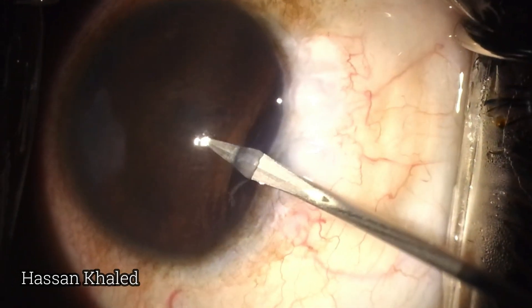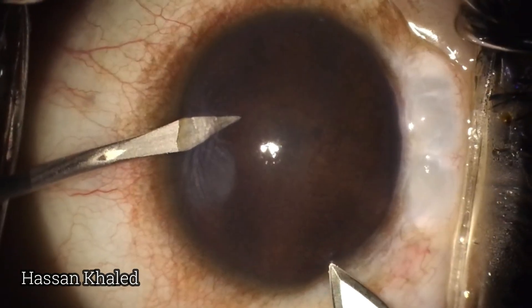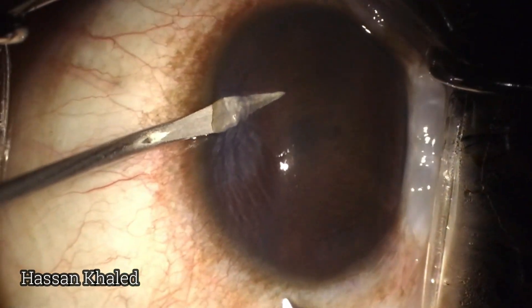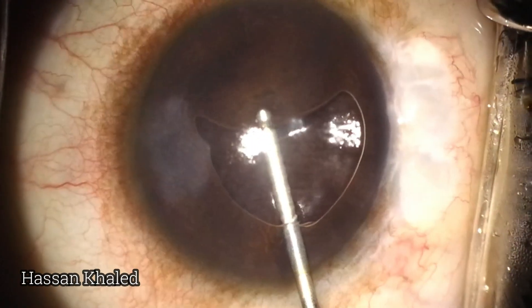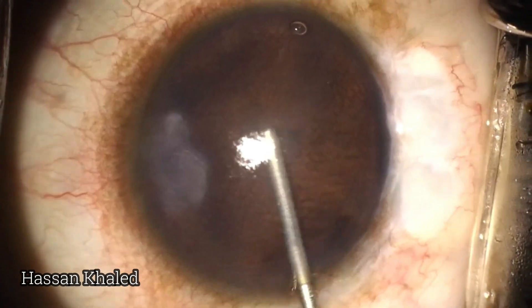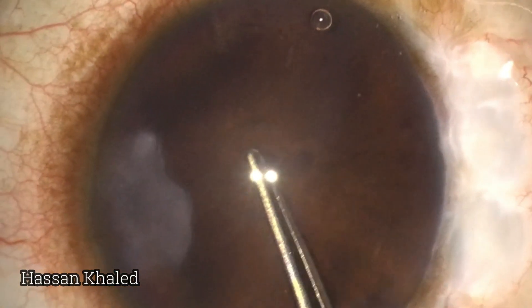I started with two paracenteses and a 2.4mm clear corneal incision. Look at the globe — it is soft while doing the incision. Then I injected dispersive OVD.